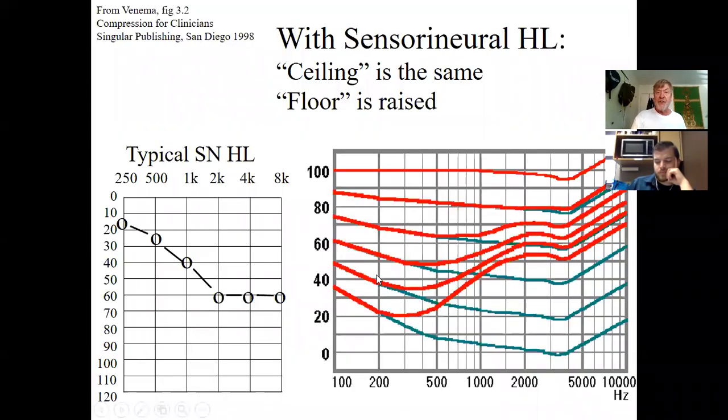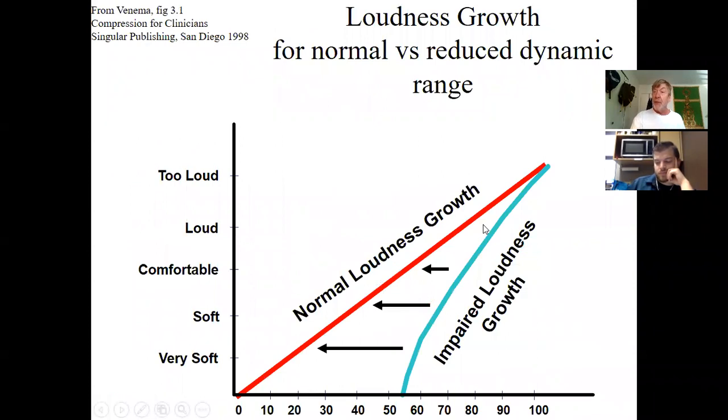So that's why hearing aids use something called compression. Hearing aids amplify soft sounds by a lot, and loud sounds by little or nothing at all. That partially explains the cost of hearing aids. Imagine an amplifier that's constantly changing the amount by which it's amplifying. If I speak really softly, the hearing aid is working its tail off. If I start to talk louder, the hearing aid automatically backs off. How come? Because loud sounds are heard just as loud by people with normal hearing as they are by people with hearing loss. And true deafness means that the floor has met the ceiling.